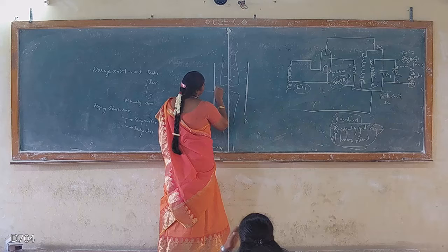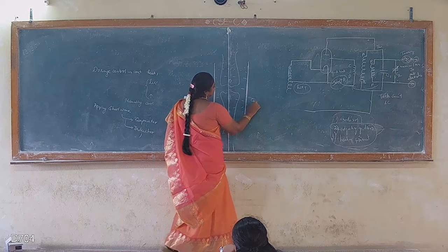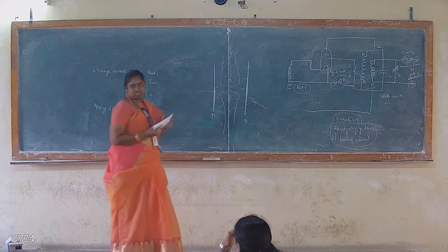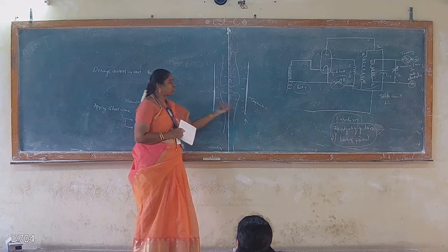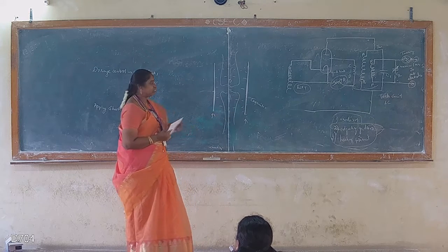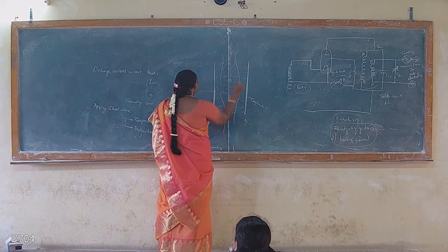The two metal plate electrodes form a capacitance effect, which means two parallel plates that we have placed. Whenever two parallel plates are formed, there will be a capacitance effect, and there may be a dielectric loss.